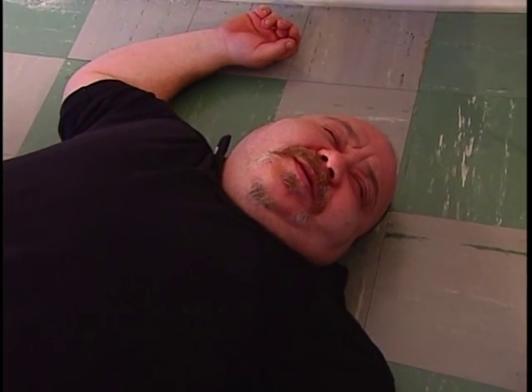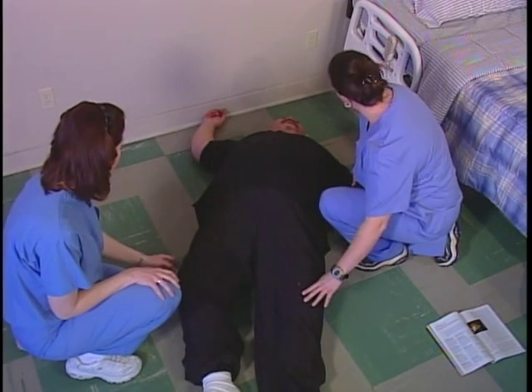Yeah, as far as I could tell. Just need to get back into the bed. If they don't need medical attention, you can lift the resident. Okay. I'll get the lift. Great.